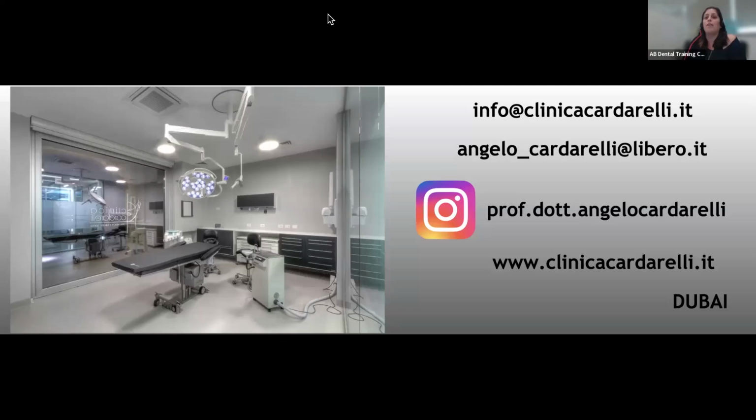Dear professor, the upper long implants look like they are inside the sinus. Why are you using such long implants? This is the question from Marcin Lodzik. Okay, I will explain for sure. If you see the surgery, the OPG is not real. It's not the real X-ray, as you know, because it is bidimensional. But using the open flap, you can see when I prepare the implant site, we are in the bone. You can't see if the implant is in the nose or not using the OPG. You need the CBCT or you need to feel it using the implant site preparation.